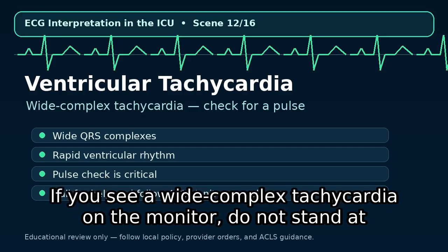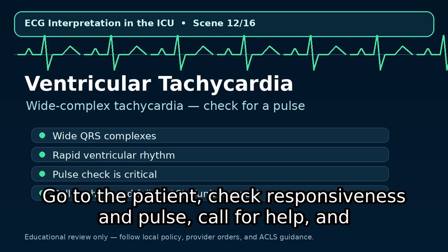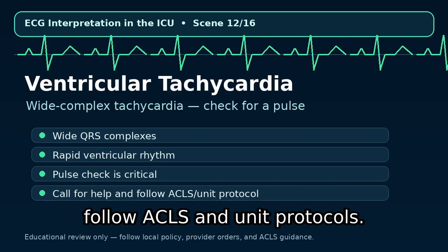If you see a wide complex tachycardia on the monitor, do not stand at the central station debating the strip. Go to the patient, check responsiveness and pulse, call for help, and follow ACLS and unit protocols.